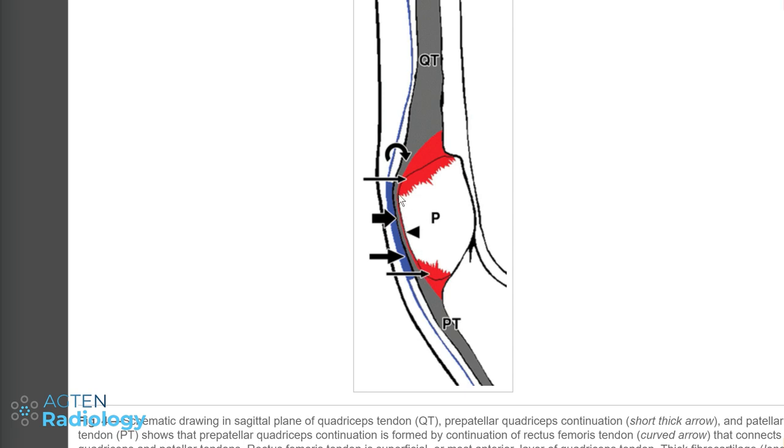Normally it's firmly attached to the anterior cortex of the patella, and you will have a hard time separating it. This is the continuation, and the thick blue stuff here is the prepatellar bursa. Interestingly there's also a long blue line here which doesn't have a name, but we will come back to that later.